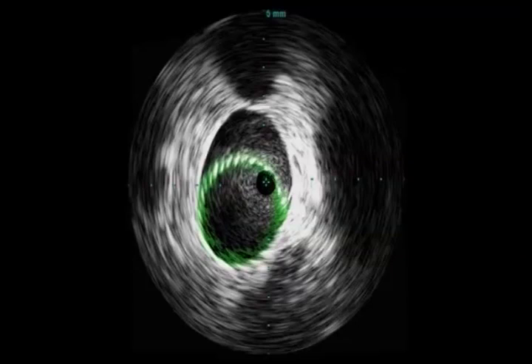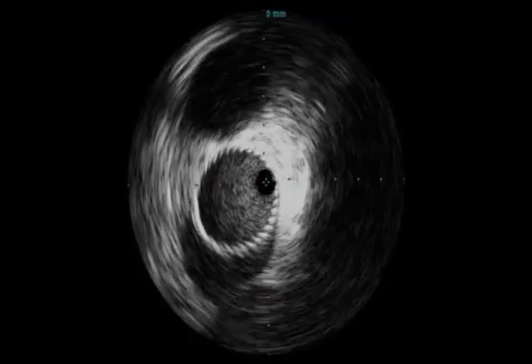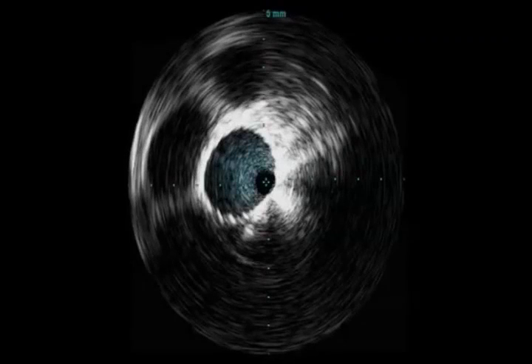And as we go down, now we're in the area where the lesion was. So this was the left common iliac vein compression site. You can see where we saw earlier the division of the artery, so the left common iliac artery and the right common iliac artery. This was compressing the vein closed, and now it has a metal stent completely opposed to the wall of the vein. The vein's big and round now. It's no longer compressed.